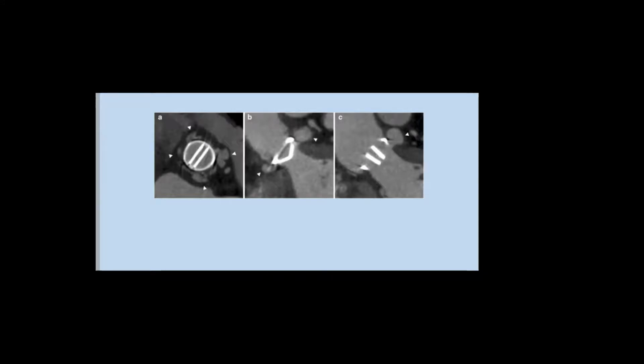As you see here, we have an aortic valve which is obstructed by a thrombus. You see the thrombus, this hypodensity or hypoattenuation shown by the arrow. Again, this is an obstructed valve, and the arrow is showing a thrombus, this hypodensity below the valve.